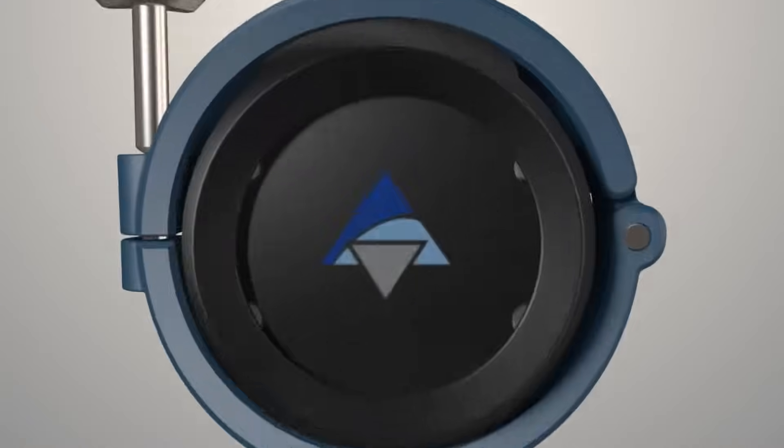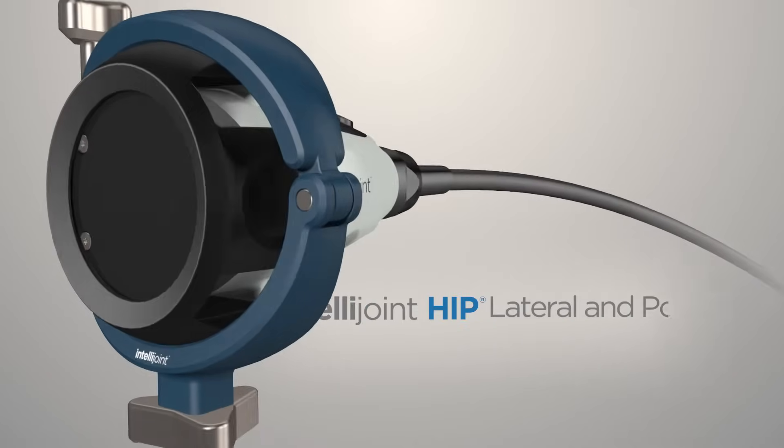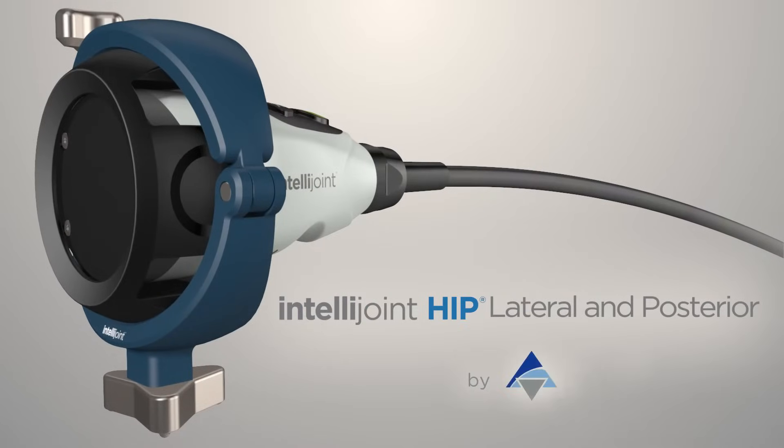IntelliJoint HIP provides surgeons with real-time intraoperative measurements for cut position, leg length, offset, and joint center of rotation. It is affordable, fast and easy to use, and is compatible with all major implant vendors, integrates with all surgical workflows, and is suitable for both primary and revision hip replacements.